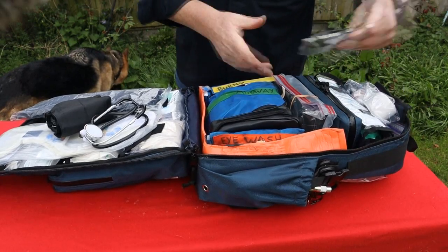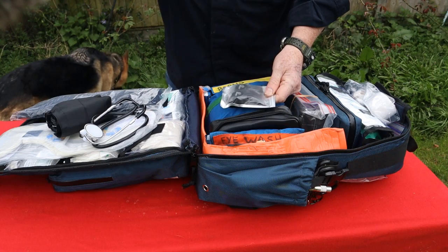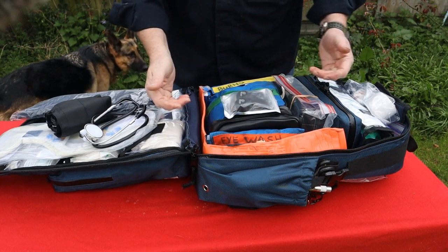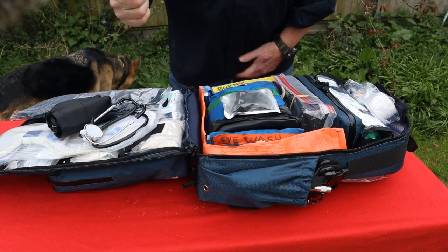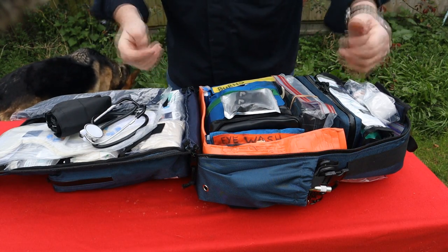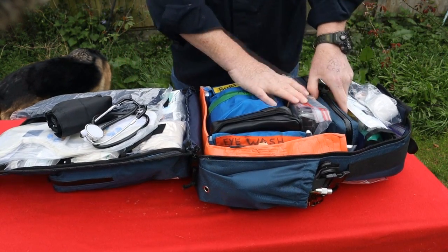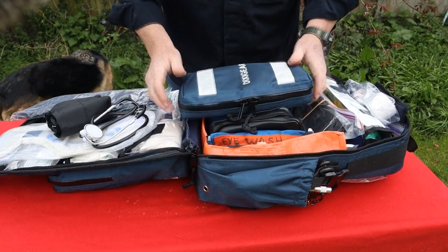you know. Couple of little torches. These ones come from Polymath products, but again, if you've got bystanders, friends, relatives, and it's dark, it's raining, like it always is, then just give them a torch. Hold that for me, and so on. They feel involved, they've got something to do, and it reduces everybody's stress if they feel involved.